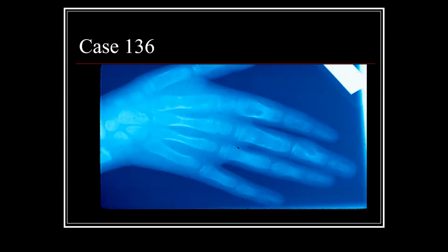The fact that it's lytic, again, it's destroying the bone, replacing the bone. And I think if we had a little bit of a magnifying glass, you might even see a little bit of the features of ring-like slight calcifications. We can also see that this is an adolescent patient, so it's a youthful patient, hasn't yet fused their epiphyses here. And this lesion is primarily in the metaphysis or diaphysis of these bones in the hand, not in the epiphysis.